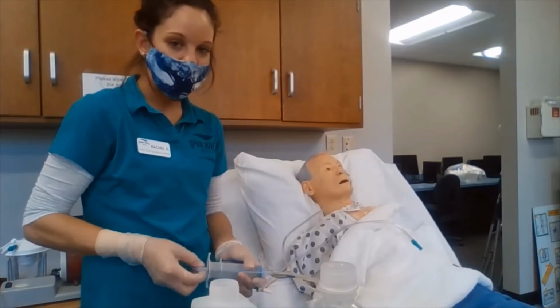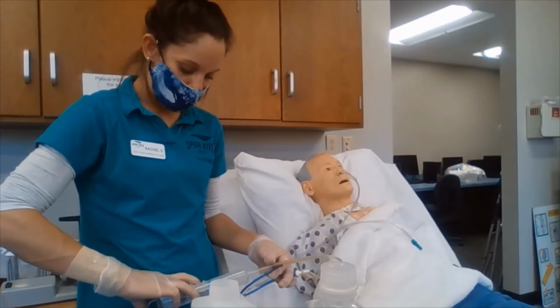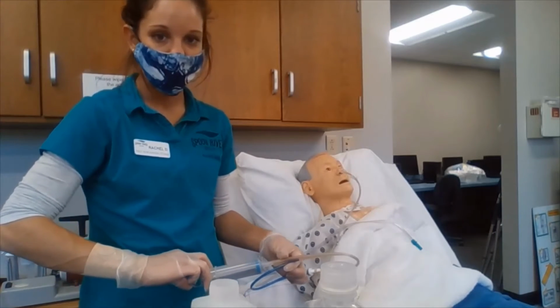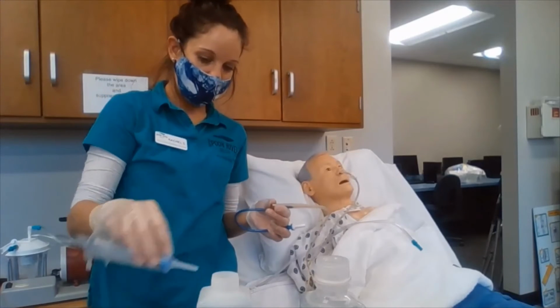And then we are going to be withdrawing fluid, and then we are going to be performing the same thing and inserting fluid back up into the tubing until the fluid flows freely. So when we're done, we're going to go ahead and remove it.